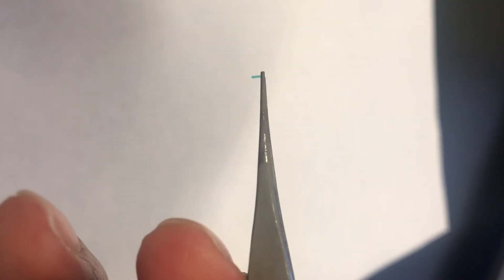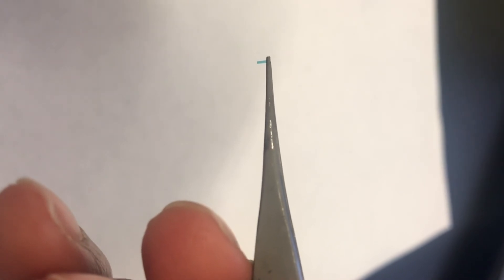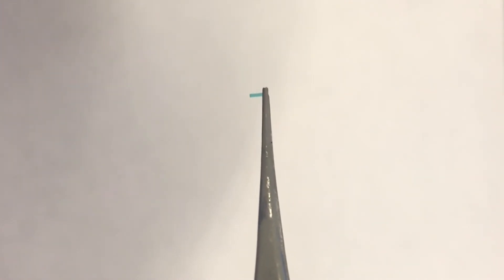This is an example of a temporary collagen plug which would be placed into your tear duct behind the microscope, where your eye doctor can see a magnified view of the small tear duct. If removal is needed, saline can be used to flush it out of the lacrimal drainage system. For the permanent plugs, they can be gently removed with forceps.